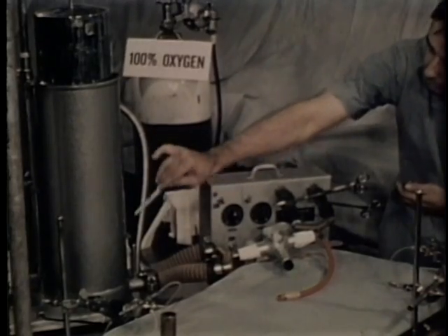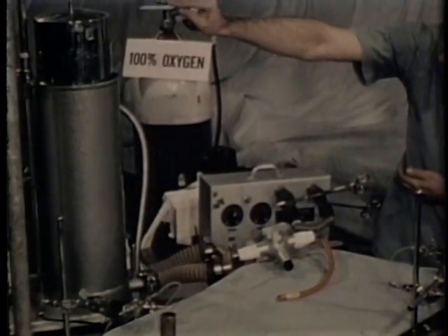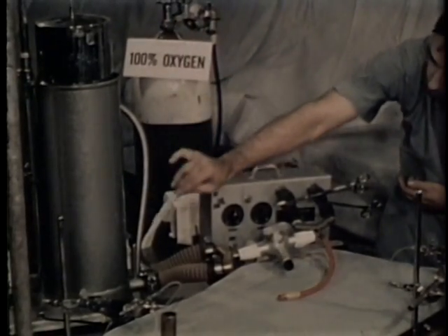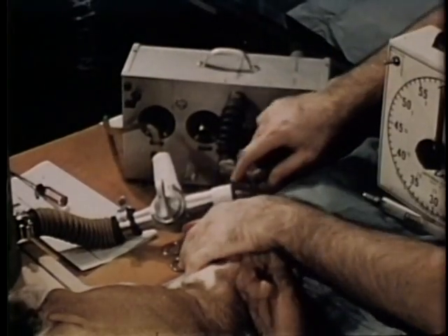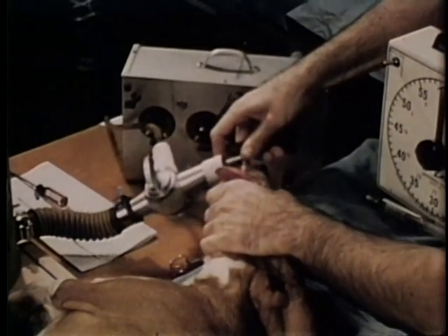The low resistance to flow of this system is indicated by the fact that the spirometer bell immediately begins to fall when the endotracheal tube is open. The animal is then placed on the operating table and the endotracheal tube connected with the ventilator.